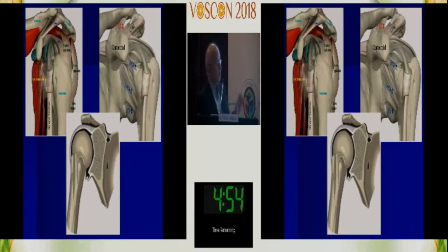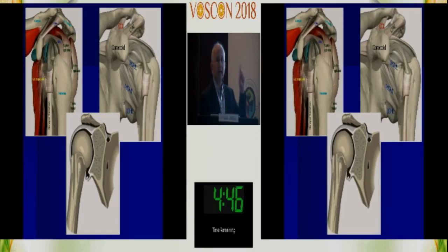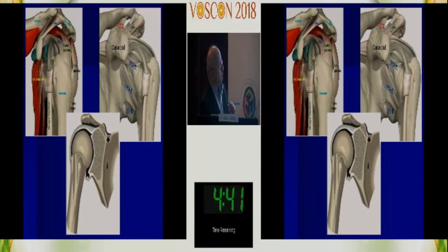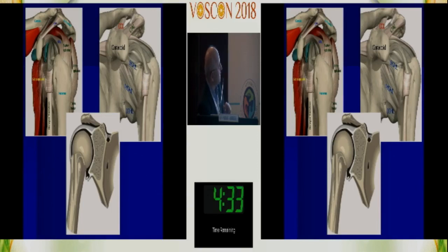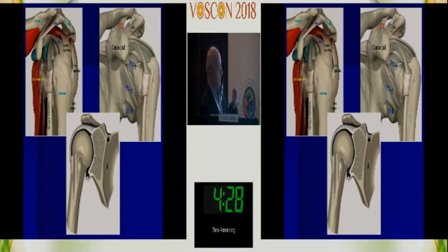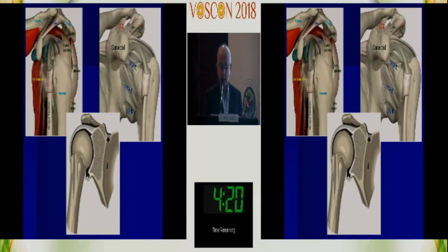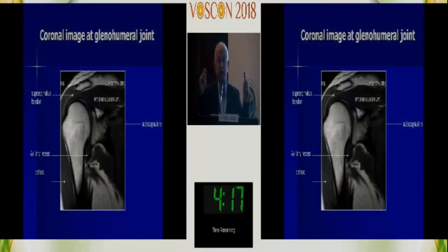A quick look at anatomy: you need to know where your rotator cuff is and where your superior, middle, and inferior glenohumeral ligaments are. MR reporting is all about anatomical correlation. Know where your coracoid is — at the base of the coracoid, the superior glenohumeral ligament is just starting. On the coronals, spare a thought for the coracohumeral ligament, which you need to look at in frozen shoulder cases. On the coronal view, look at the labrum at the top and bottom ends.